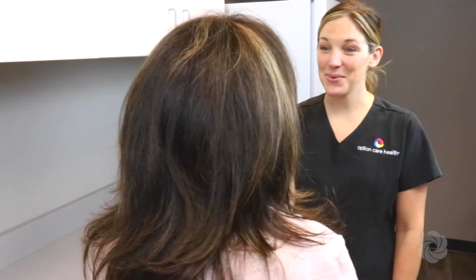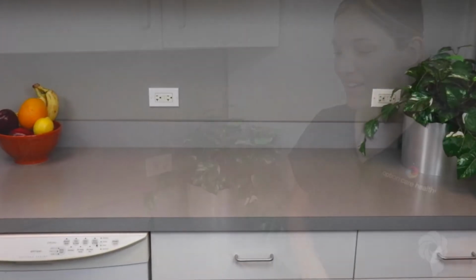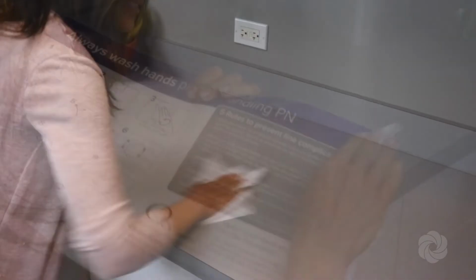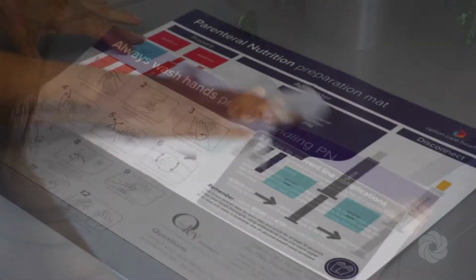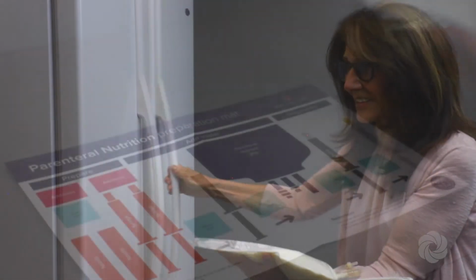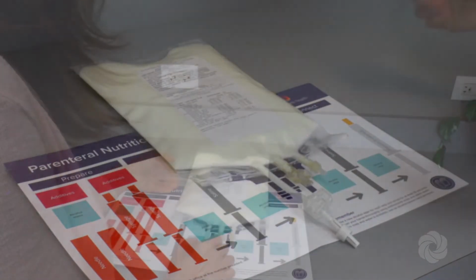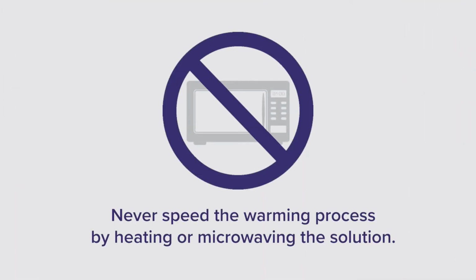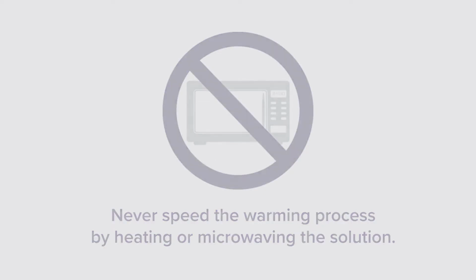Prior to preparing your PN solution for administration, select an uncluttered work area. Clean the work area with warm, soapy water or antimicrobial cleaning agent. Remove the PN bag from the refrigerator and place on the PN preparation mat. Read the label to determine the amount of time needed to allow the PN bag to reach room temperature before administration. Never speed the warming process by heating or microwaving the solution.